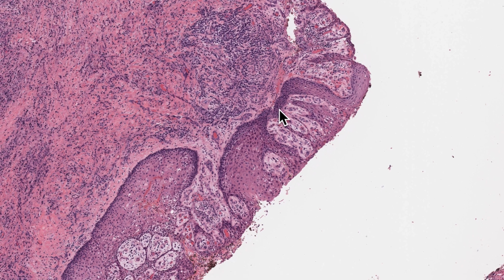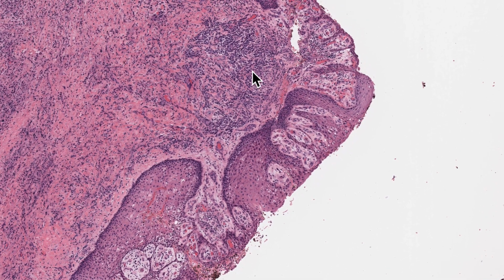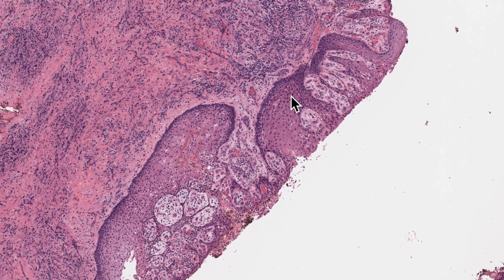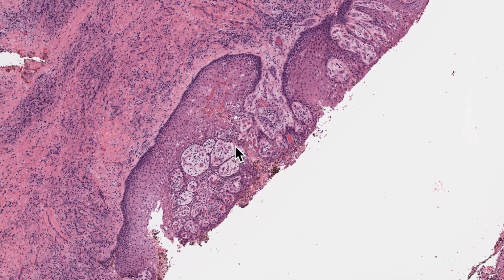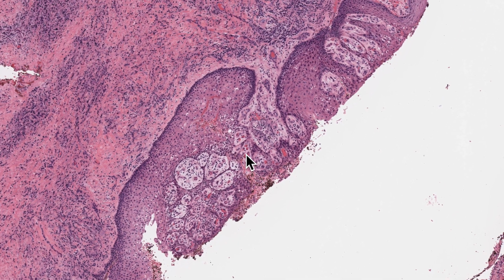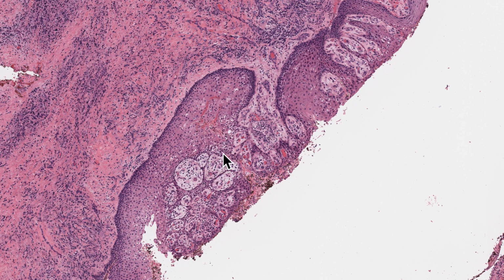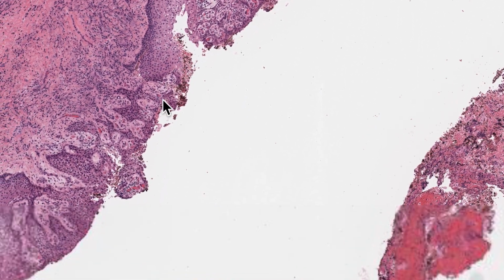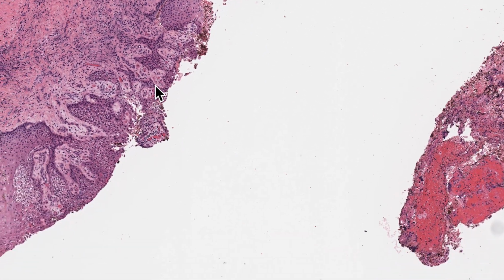If you see this epithelial lining, because of the inflammation, the epithelium starts to proliferate, and the uniform thickness of 5 to 8 cell layers is no longer maintained. Instead, it starts to show the plexiform arrangement like what we see in a radicular cyst, or the arcading pattern we see in a radicular cyst. So the inflammation has a huge effect. It is trying to mask all the features of a typical odontogenic keratocyst.